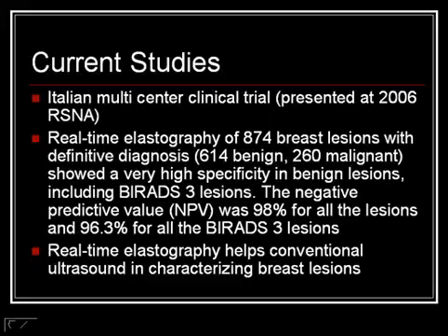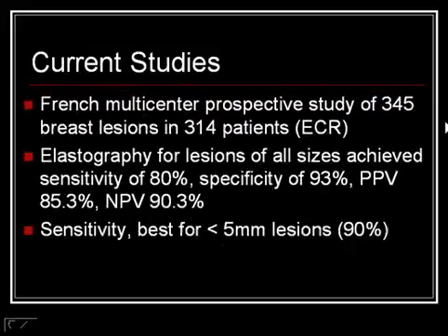The evaluation with real-time elastography showed a very high specificity in benign lesions, including BI-RADS 3 lesions. The negative predictive value was 98% for all the lesions and 96.3% for all the BI-RADS 3 lesions. Real-time elastography does help conventional ultrasound in characterizing breast lesions.